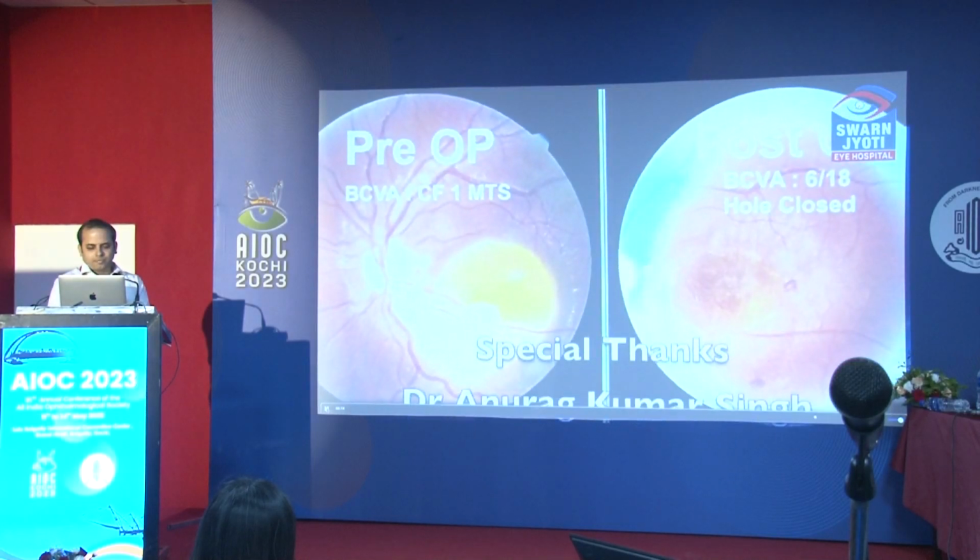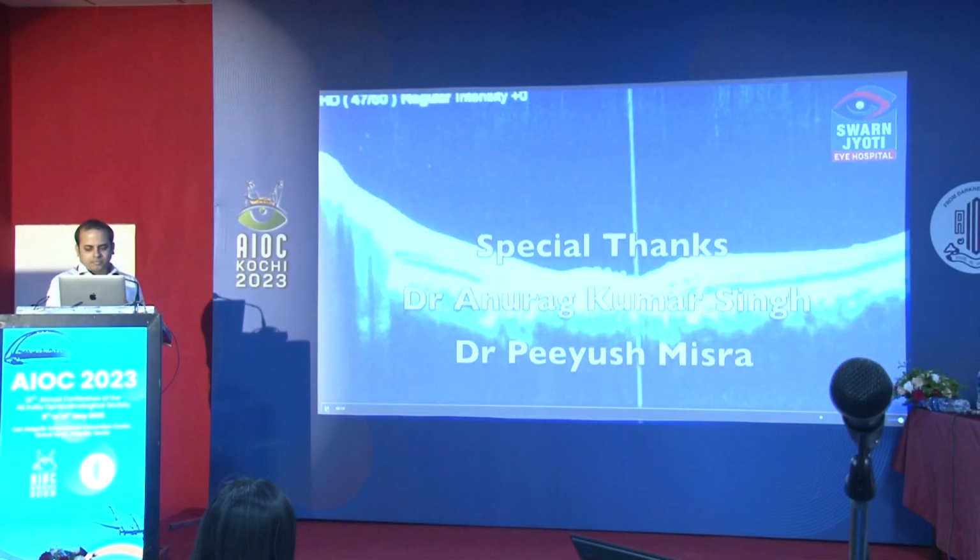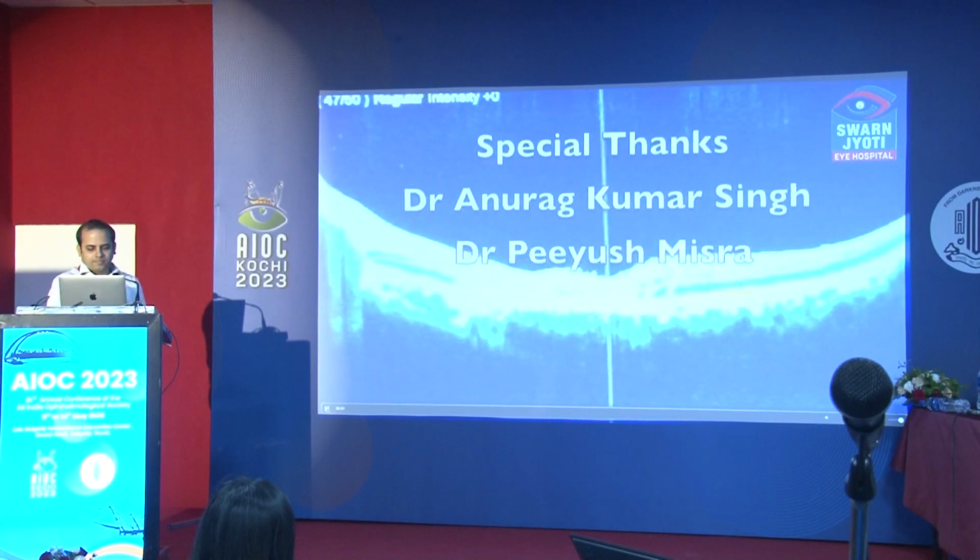So we got good outcomes after the surgery, a vision of 6/18, and the hole was closed.